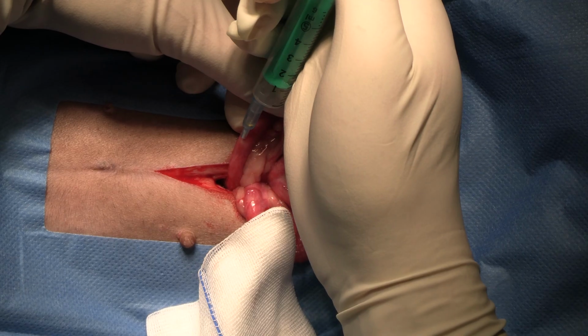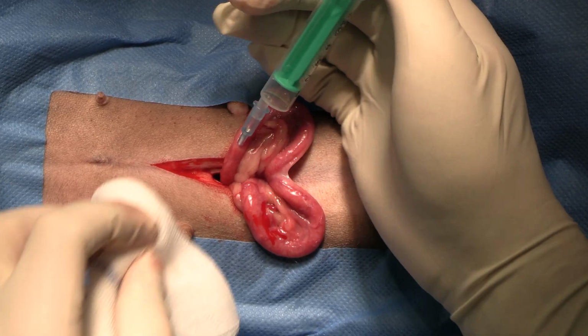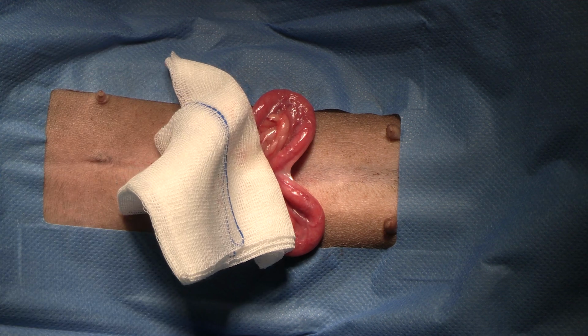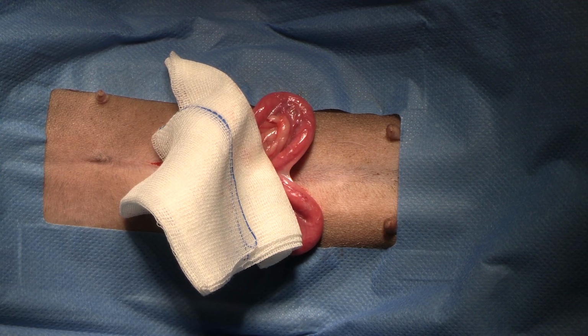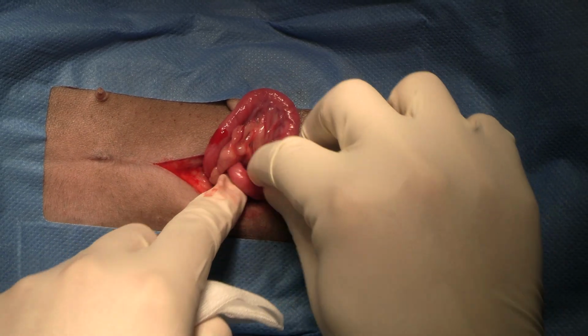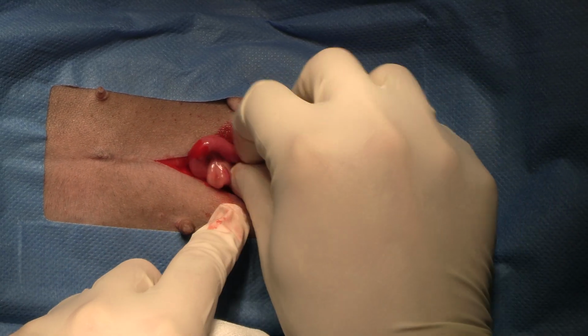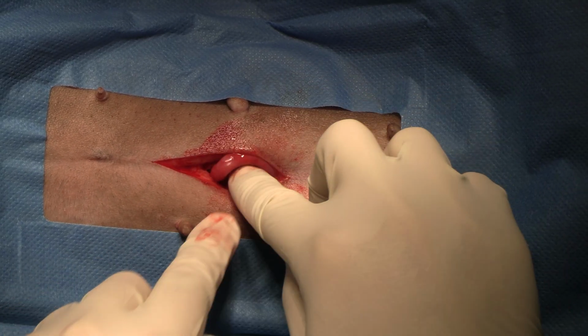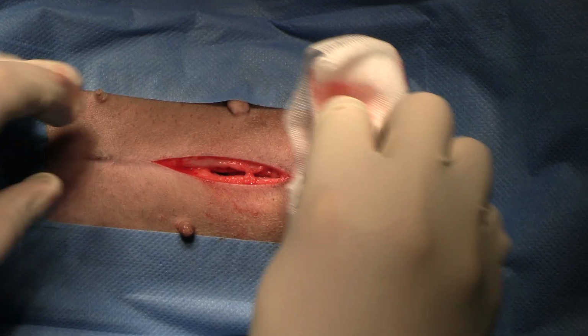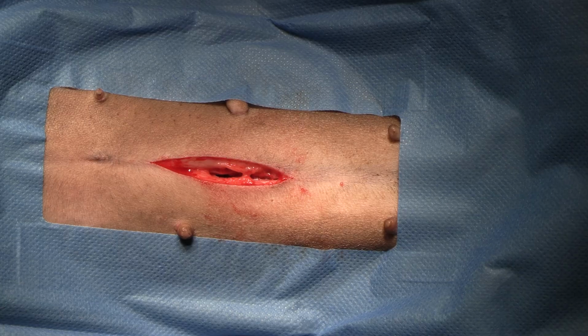Once we've got all the semen in, now reverse the process. This one goes in, and this one. Why do I not clamp it off? I would just rather have that blood go outside the uterus than inside the lumen. Whether or not that is actually true, I'm not sure.